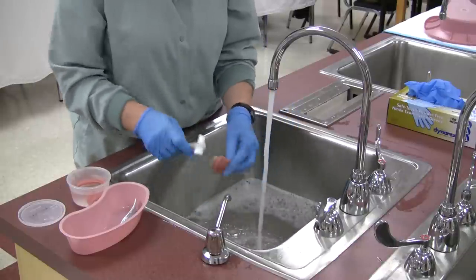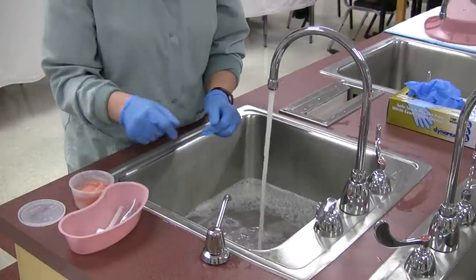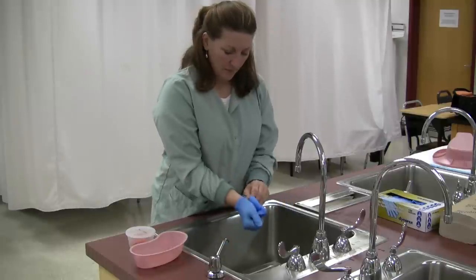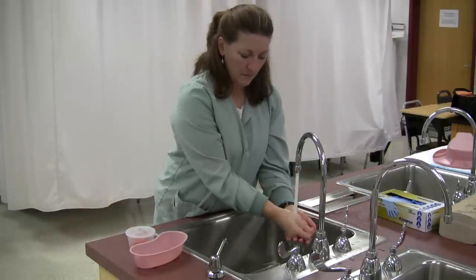Maintain clean technique with the placement of the toothbrush and denture. Remove the sink liner or drain the sink after rinsing the equipment. Remove and dispose of gloves into a waste container and wash your hands.